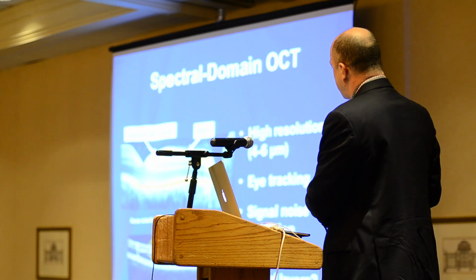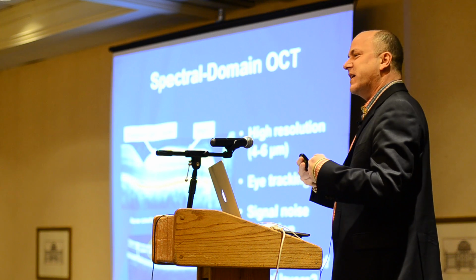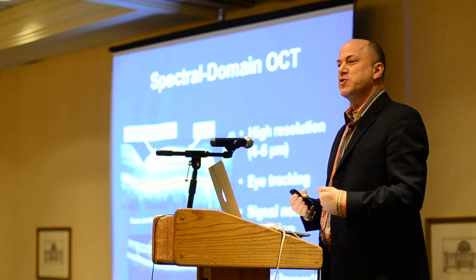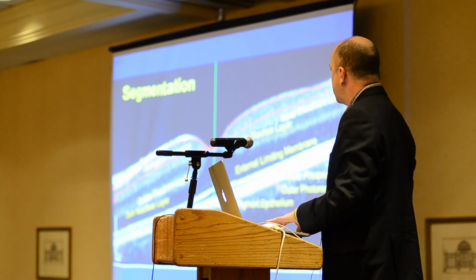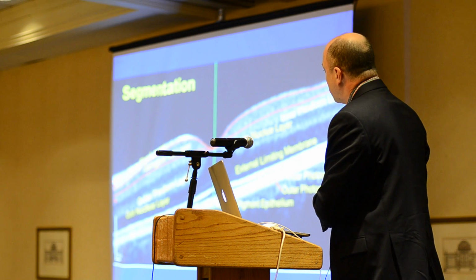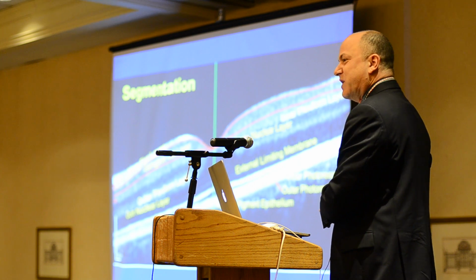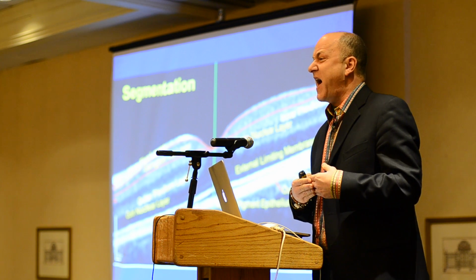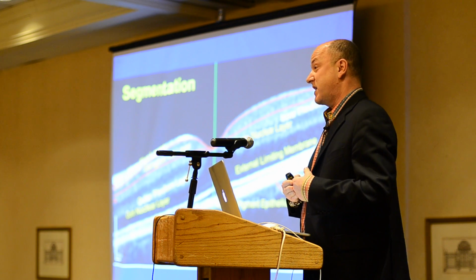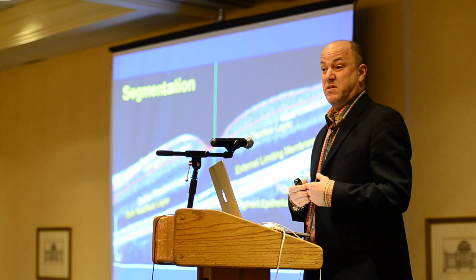It has high signal-to-noise reduction, and it allows us, more importantly, to identify the individual sublayers of the retina. Why is that important? Because, as I told you, we've been looking at this layer of cables. But sometimes we can't tell if that layer is thinner because you've actually lost cables, or maybe the cables are just shrunken and thinned down.